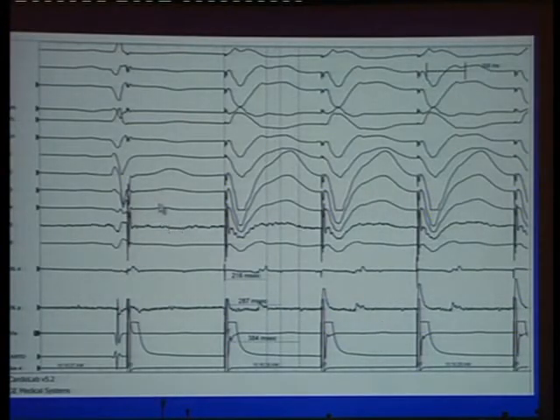Back to our surgeon, who's now in the cath lab, we've shown we can induce this tachycardia. So the way we do it, and it tends to be a low stress thing, certainly less stressful in doing the mapping and ablation than it is doing pulmonary vein isolation, at least I find. And what do we look for?